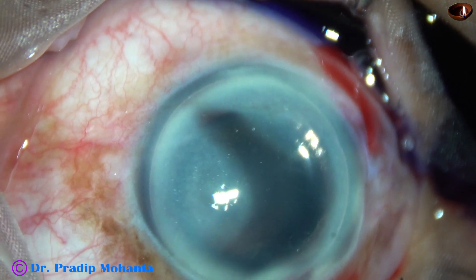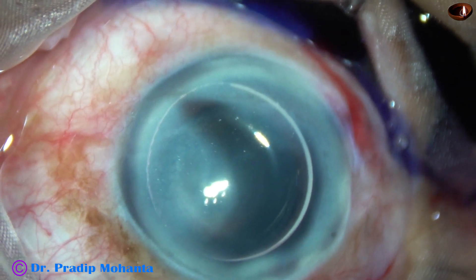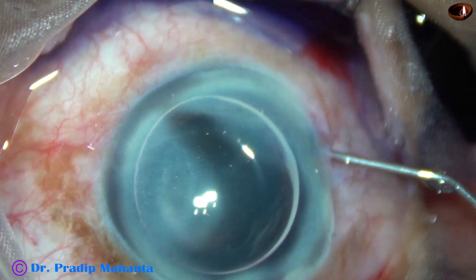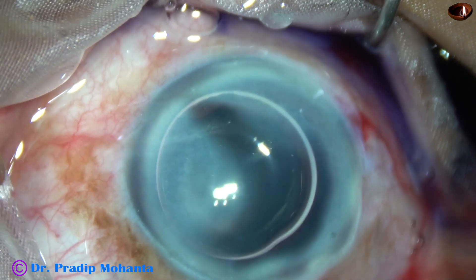So this is some amount of adrenaline so that dilatation of the pupil becomes a little more, or at least whatever dilatation has occurred, that is maintained.